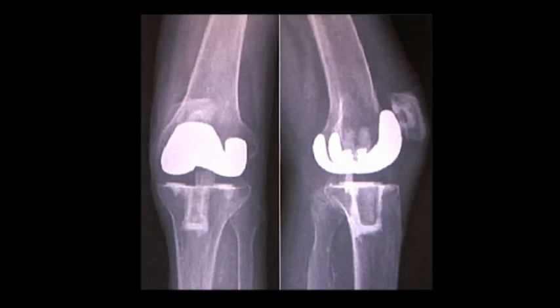And the rotatory movement in the knee, which was one of the major causes of loosening of the early implants, was permitted in these designs, and the implant was therefore much less stressed than in the early ones. The total condylar replacement was designed to replace both cruciate ligaments. It was the first to replace all three compartments, including the patella.